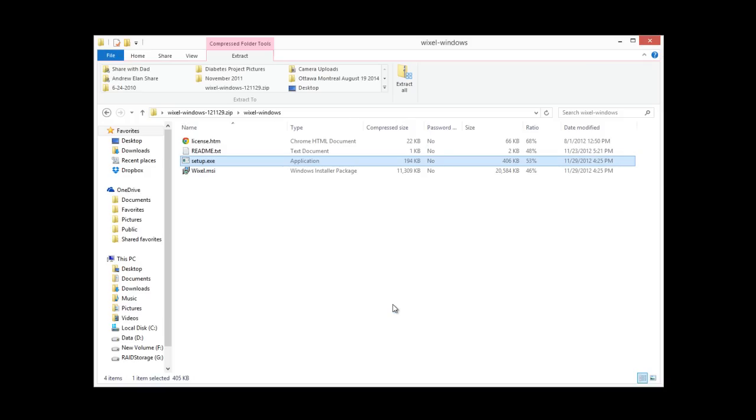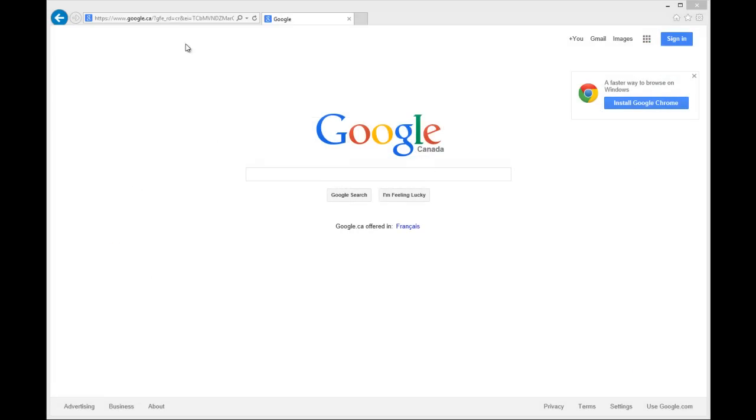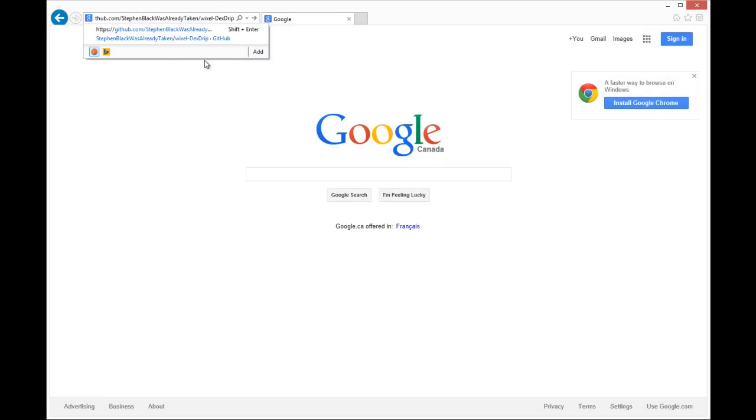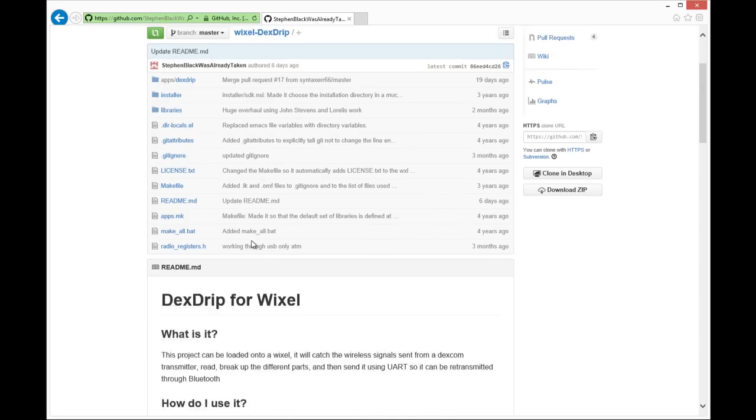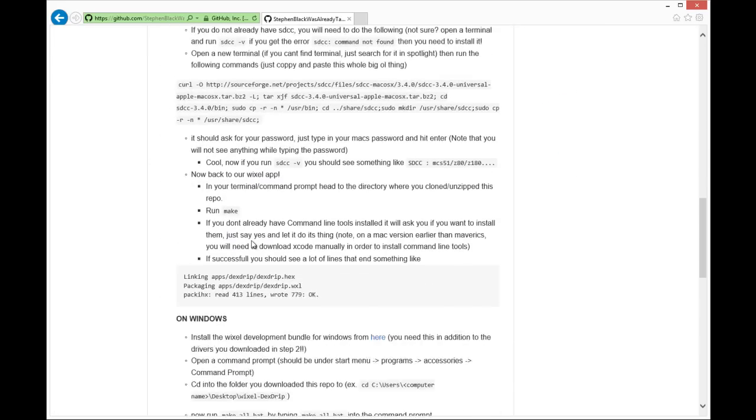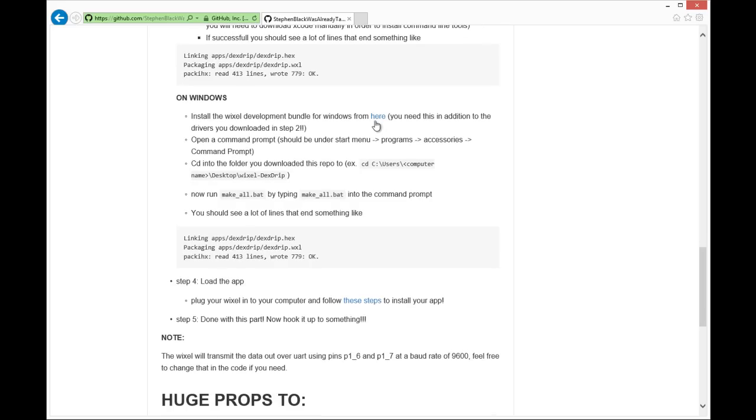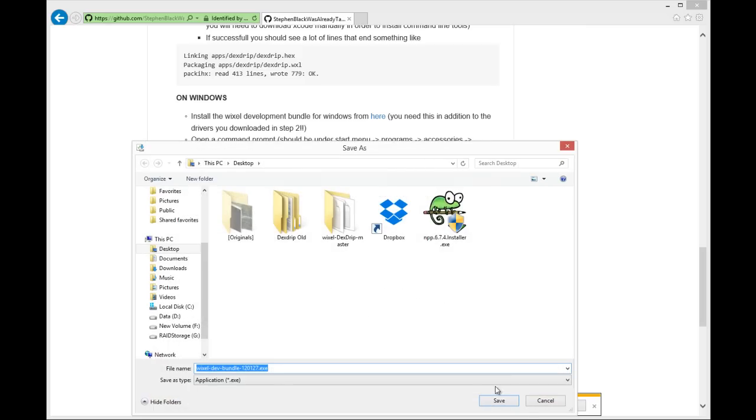Next thing we're going to do is download the Wixel development bundle, which is required to build the app. And from there we hit save and save it to the desktop.